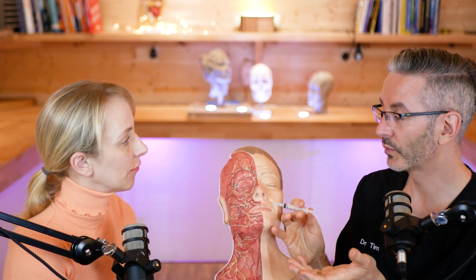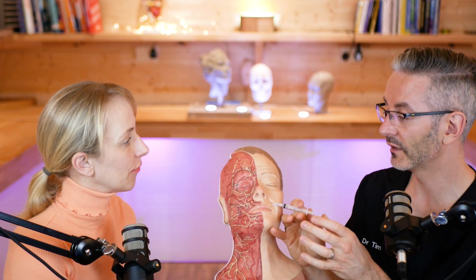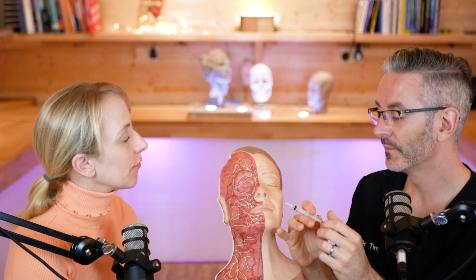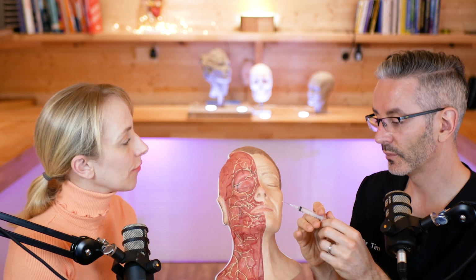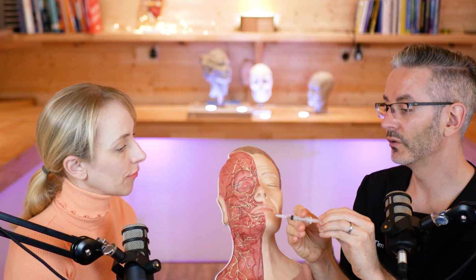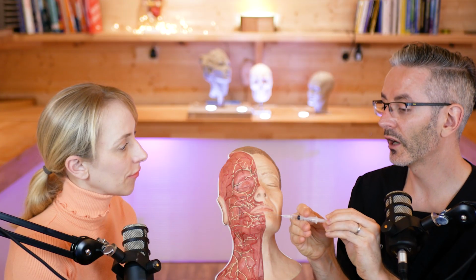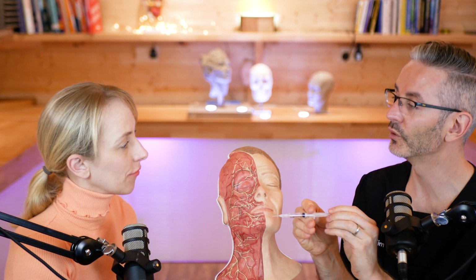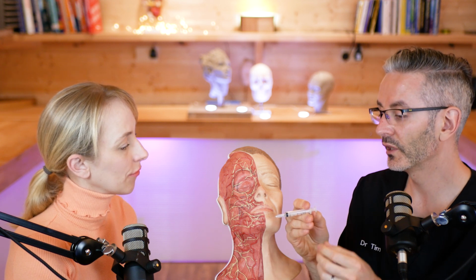So the other thing you need to practice is how you are actually going to aspirate. There's lots of practice and many different ways of doing it. One of the key things I've taught before in different videos is you need to find a way of aspirating that has a neutral vector across the syringe. What I mean by that is, if I pull with this hand against this hand, it's going to be very hard for me to maintain complete neutrality across the syringe, because one hand is likely to be slightly stronger than the other and it will move the tip of the needle. So you want to find a way of doing it.